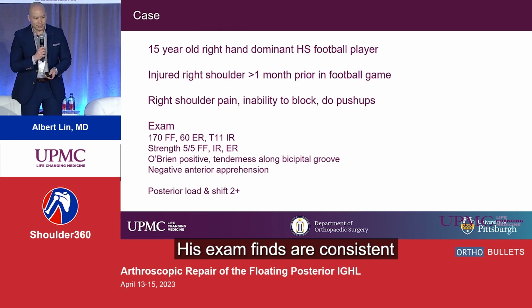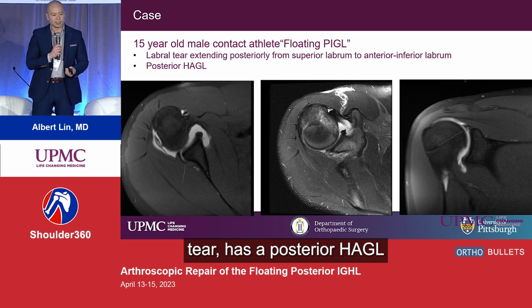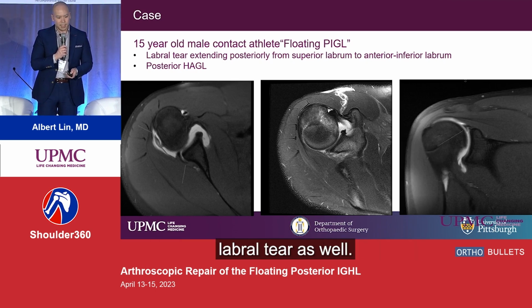His exam findings are consistent with posterior instability. This is his MRI. He has a posterior labral tear, he has a posterior Hagl, he has extension to a SLAP tear, and some extension to an anterior labral tear as well.